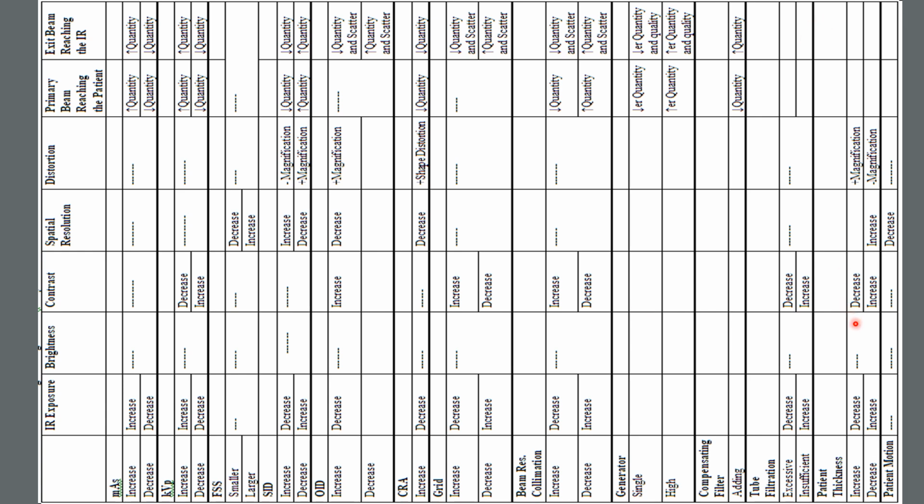As you're going through your career or your schooling, you should be watching when using the AEC in the rooms, and at what kVp and mAs the machine is shooting. Then over time, you can get a range and averages of the values to use for different views. This is important because then you can set a fixed technique on your own.